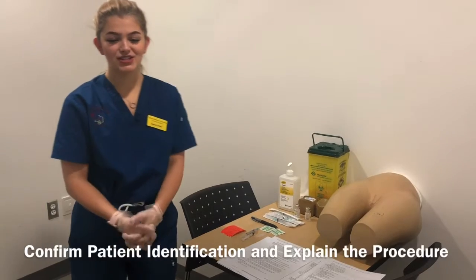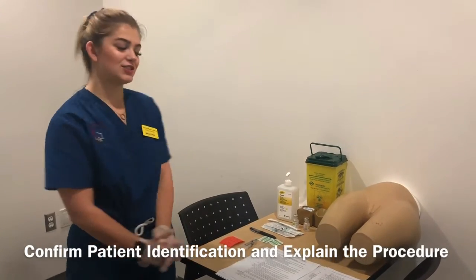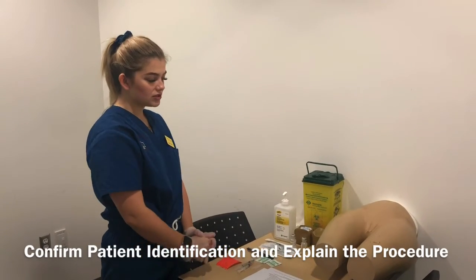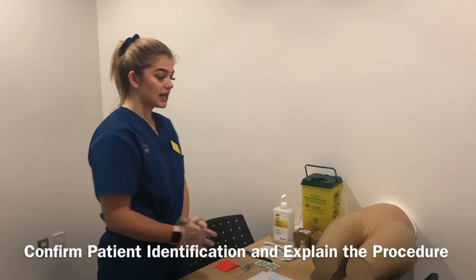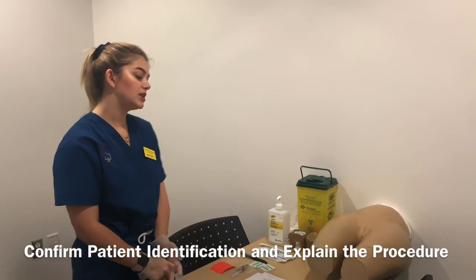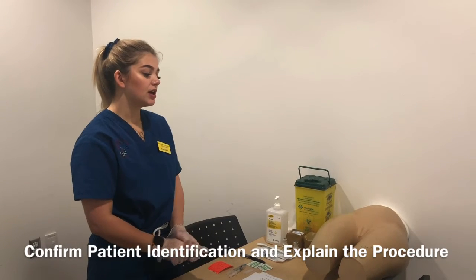So I'm going to confirm my patient identification and explain my procedure to my patient. So, hi Mr. Mancini, my name is Megan. I'm a level 2 nursing student at Conestoga College, and today I'll be giving you 2 injections. One will be heparin, which will be given subcutaneously, and one will be Haldol, which is administered intramuscularly.